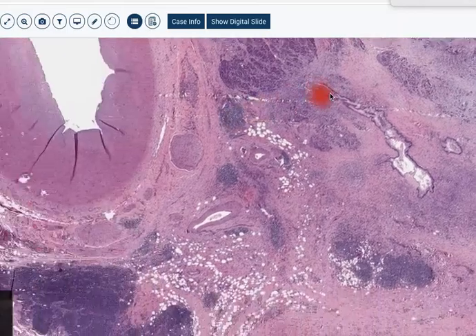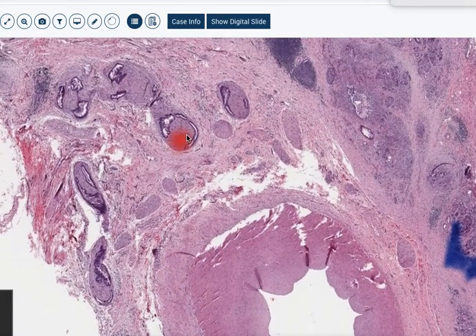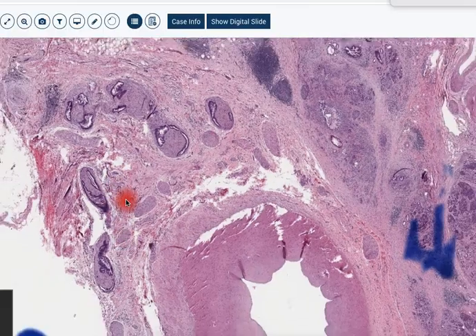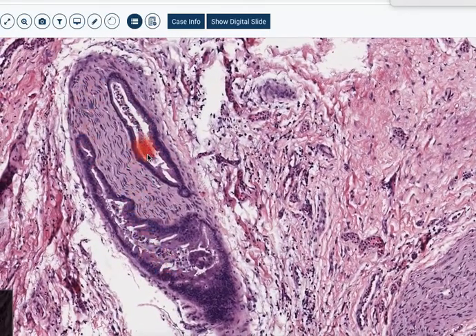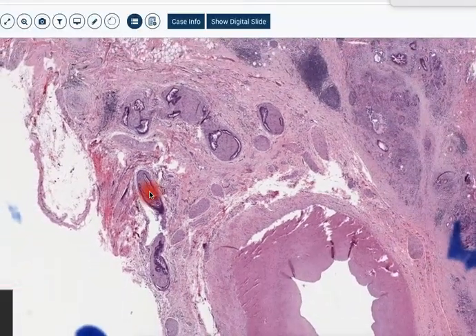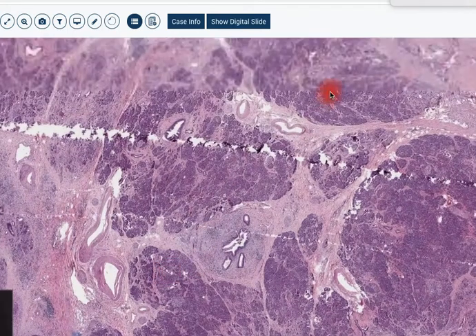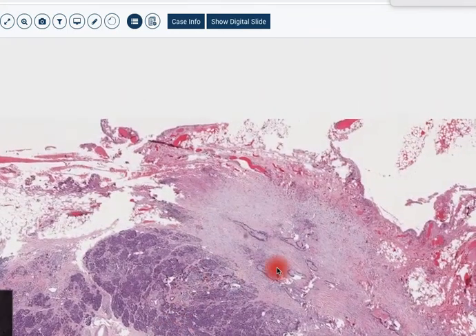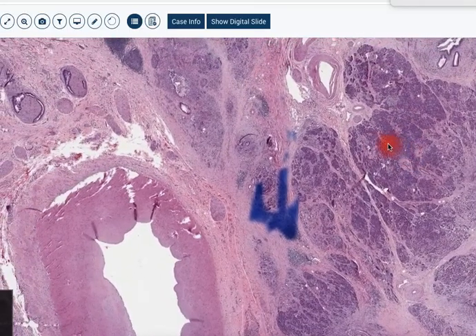And then finally, kind of the coup de grace, certainly the easiest finding here to identify in this lesion. At low power, you see lots and lots of perineural invasive neoplasia. So here we see actually the nerve itself being split apart and surrounded by these same type of glands that we saw elsewhere in this case, with mostly basal nuclei, but again, some luminal inflammatory cells. So this is an example of a well-differentiated ductal type adenocarcinoma with several of the key hallmarks that we look for in defining malignancy. Areas of in situ neoplasia, small glandular infiltration, large glands located in places where they don't belong, and finally, perineural invasion. All of those are good hallmarks for invasive neoplasia.